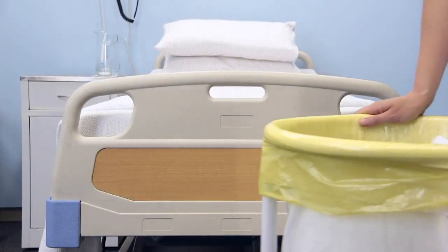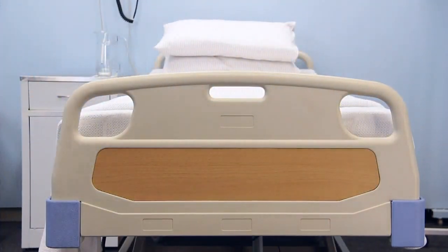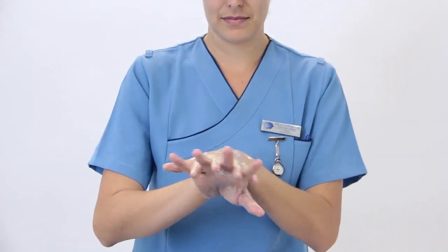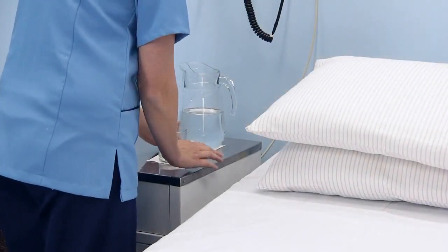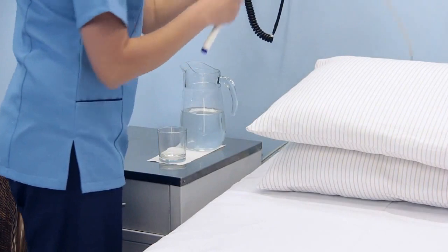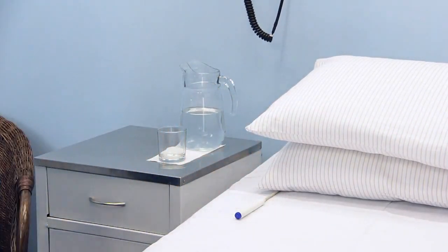Dispose of soiled linen according to the internal policy of the facility. Perform a social hand wash. Ensure that the bed locker, water jug with a glass, and the call bell is within reach of the patient. Always ask the patient if there is anything else he or she needs before you leave the room.